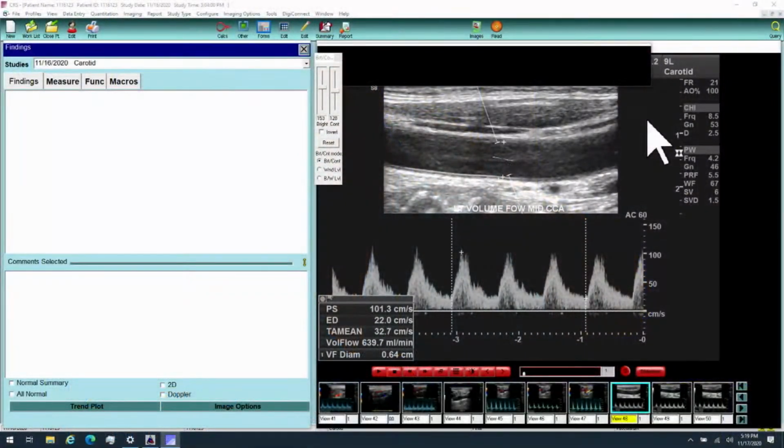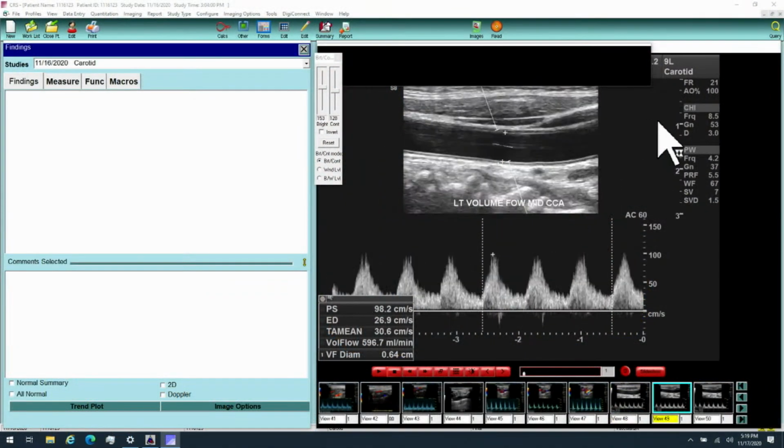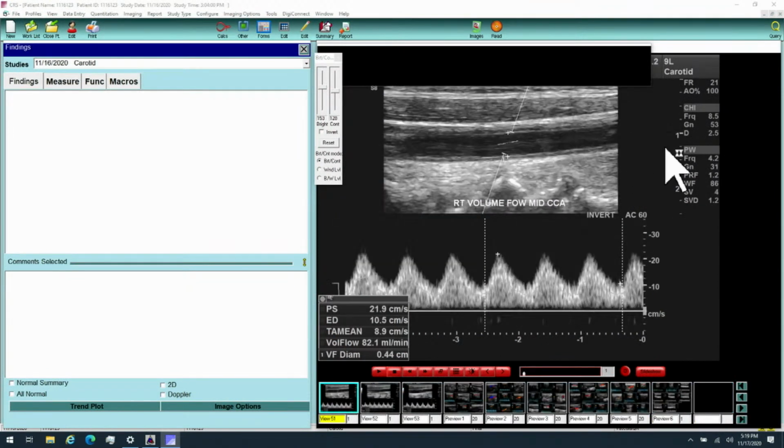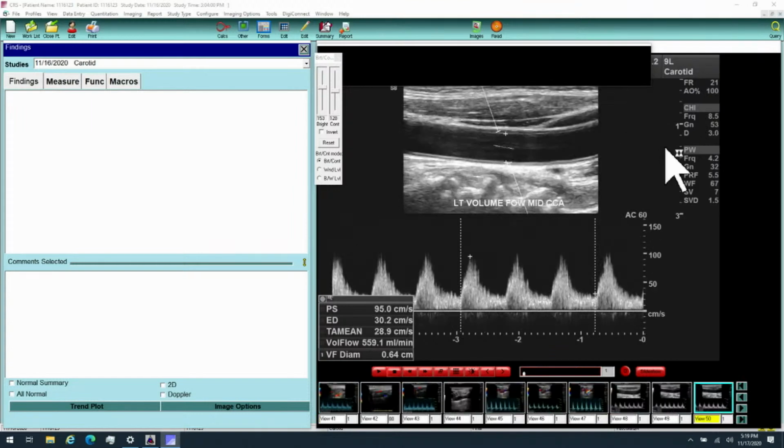And in this case, I think it was definitely obvious. So the left side was 640 here. 640, okay. And we're taking a few more. Everything seems to be pretty consistent or within range. And on the right side, this just is the right side, which is only 82. Wow. That's insane.